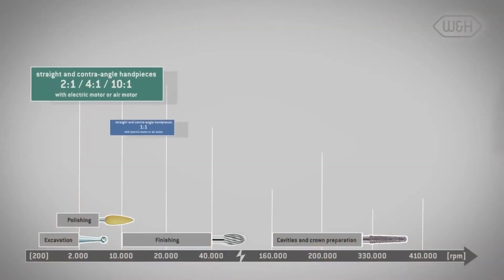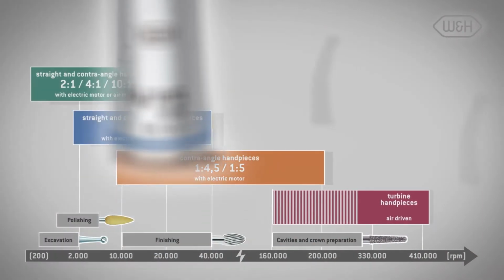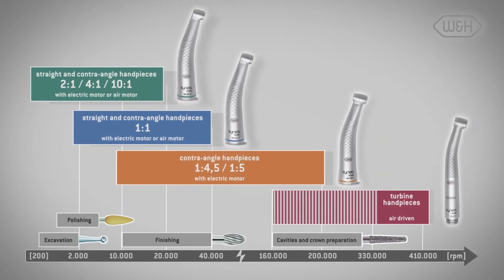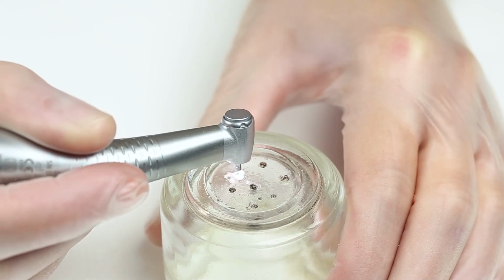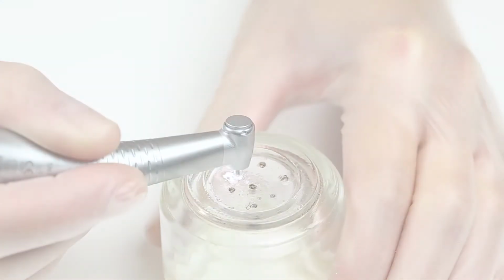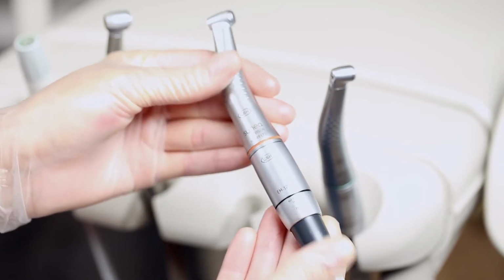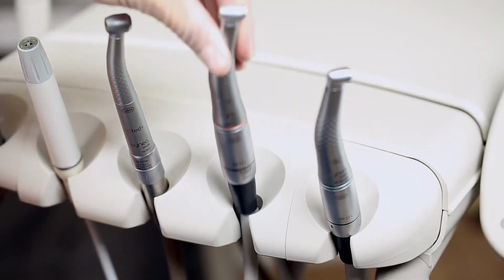In comparison, high-speed contra-angle handpieces can be adjusted within a speed range of approximately 10,000 to 200,000 RPM, and can therefore also be used for work which would demand a turbine and an additional contra-angle handpiece with an air motor. Red contra-angle handpieces also offer a constant adjustable speed, and their sound is at least less unpleasant. These contra-angle handpieces must be driven with an electric motor. The entire system is therefore heavier and more costly than an air-driven dental turbine.